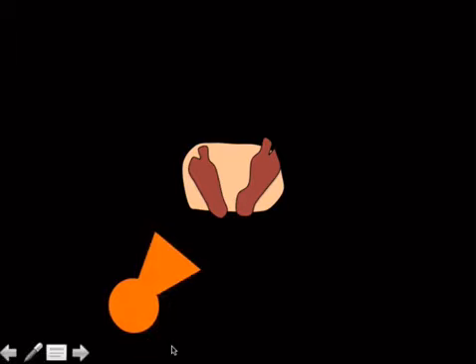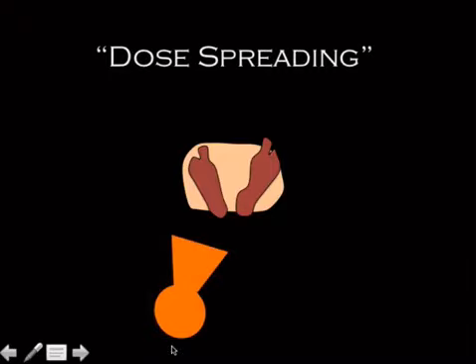It's just sort of moving your image, your X-ray generator around, moving your source around so that you're not burning on the same spot. Like I mentioned before, let's say that you're doing a TACE on somebody, you don't want to put a big burn on the left side of their back. Boom. They don't like that, and they probably will sue you for it or try to.